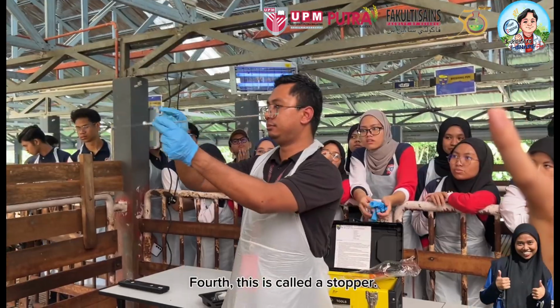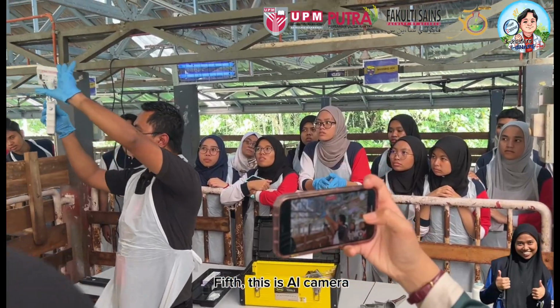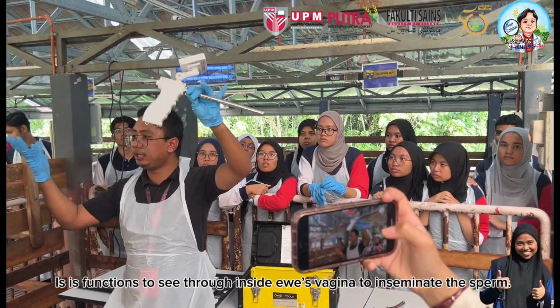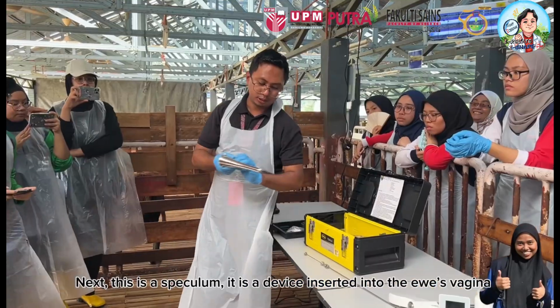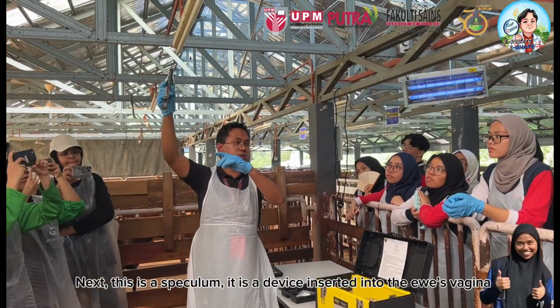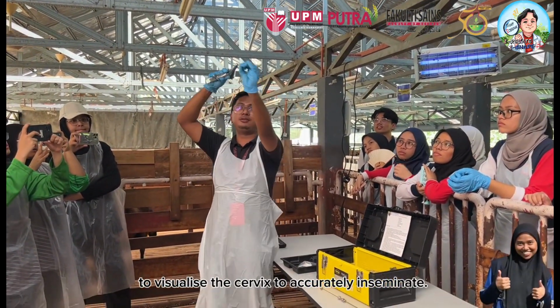Fourth, this is called a stopper. Fifth, this is an AI camera. It is used to see through the inside of the vagina to inseminate the sperm. Next, this is a speculum. It is a device inserted into the vagina to visualize the cervix to accurately inseminate.